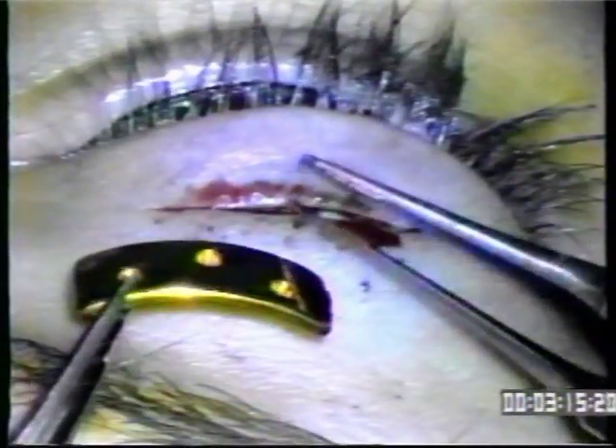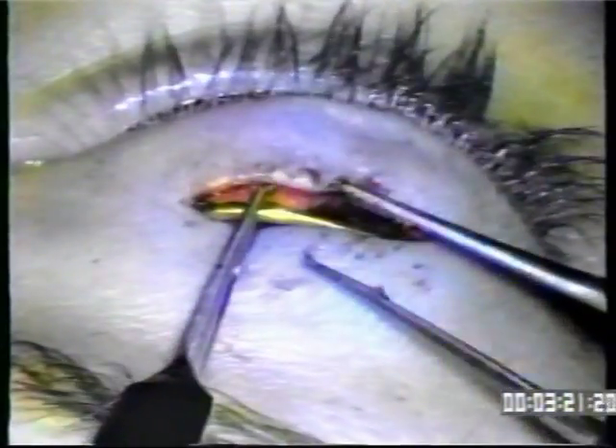We use 8-O ethilon, which is a permanent suture. It will be placed through the lower hole — not into the tarsus. This is very important: do not put the suture in the tarsus but rather in the soft tissue attachment from the lid to the tarsus. Now we try it for size in the pocket and it fits quite well.